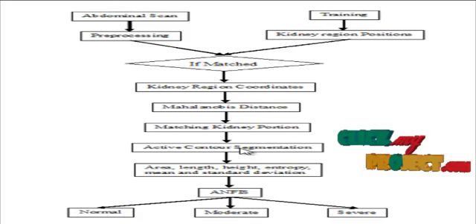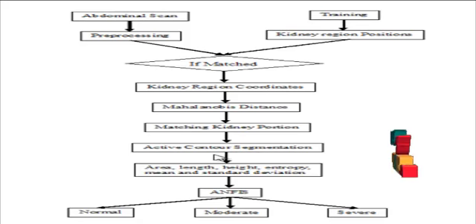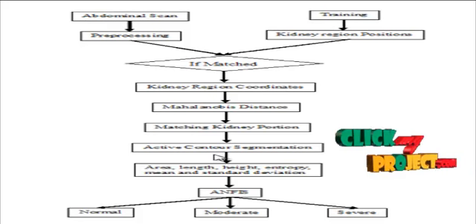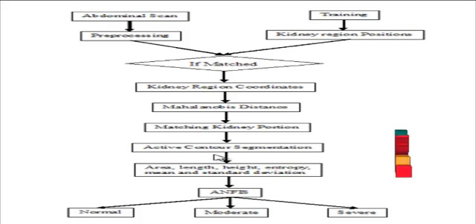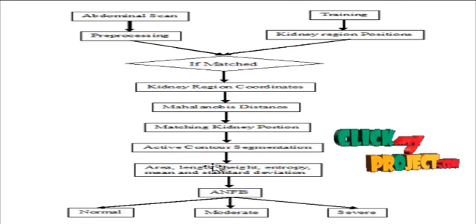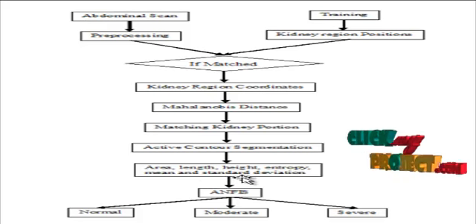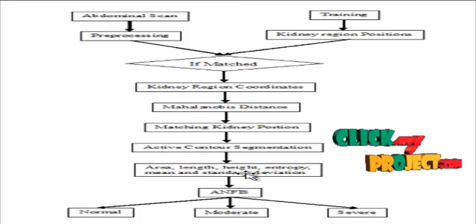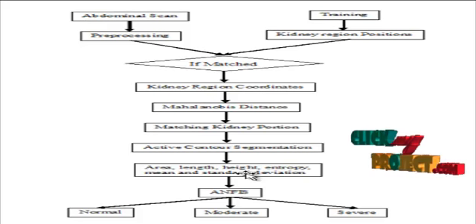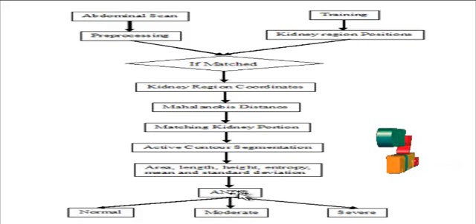After the segmentation, we extract the features from the images based on area, length, height, entropy, mean and standard deviation values. These extracted statistical values, along with the other values, were calculated and given as input for the adaptive neuro-fuzzy inference system.